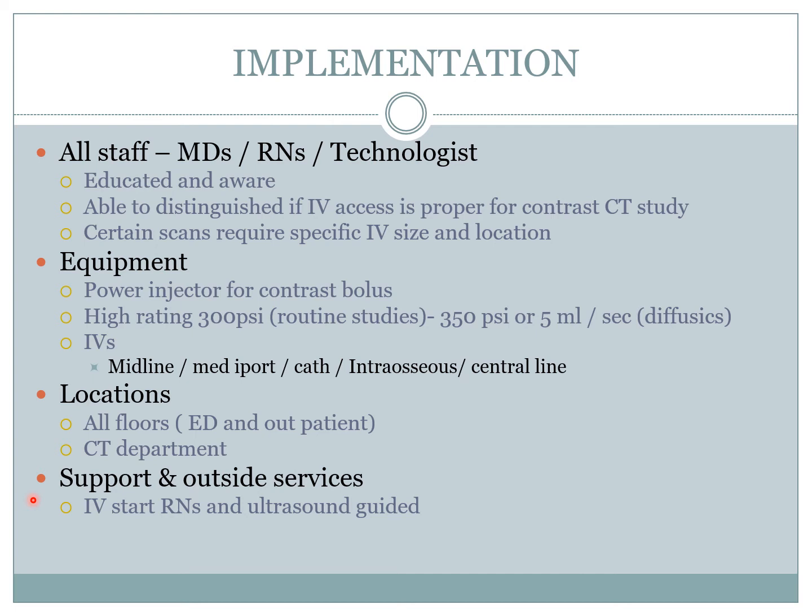I've seen IVs on the thumb, on the toe, in between the toes, and it's pretty insane where we can get lines from. So if there's a will, there's a way, and ultimately if there is no peripheral one, as I mentioned earlier, there is the central line. And we do have ultrasound guided IVs that sometimes work and sometimes they don't work.